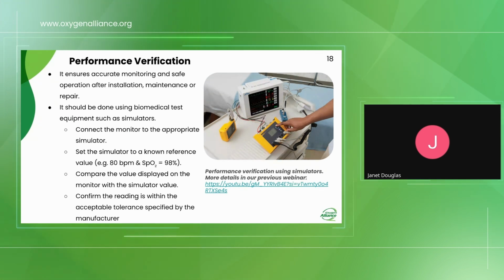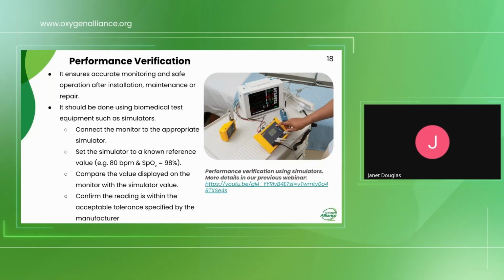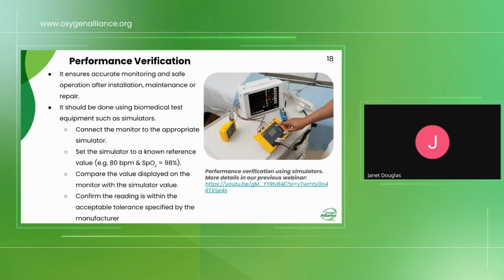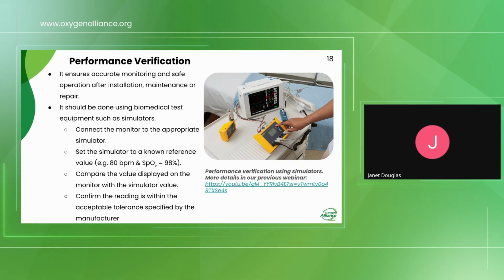There was also another question about the testing of electrical safety. As David was explaining, he mentioned the leakage current and the like. For this, you use the electrical safety analyzer. If you have access to an analyzer, it comes with a manual that explains what to do. But in brief, you are supposed to check the class of the device you're measuring. If you're looking at leakage current, we measure the points of contact between the device and the patient. Any point where there can be transition of current, that's where you connect your analyzer.